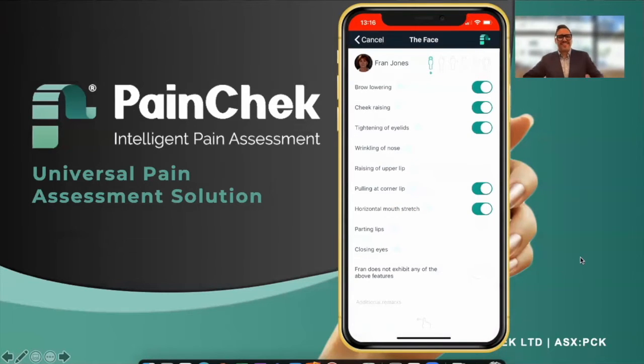Great, thank you, Dave. So we've now conducted a 3-second facial analysis. Thank you again, Dave, for your impressive performance there. Managing to successfully emulate, we can see 5 of 9 possible facial expressions that are indicative of pain.